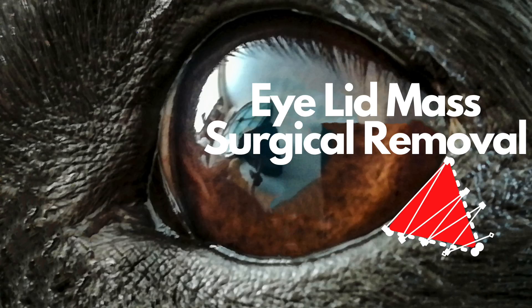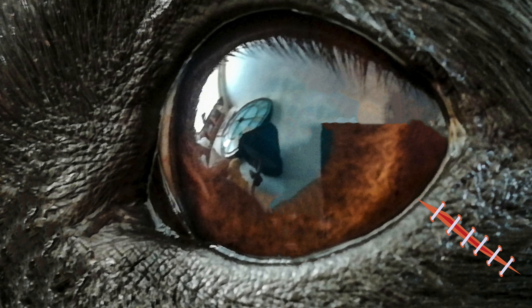After you do that, the veterinarian will close it with an interrupted pattern using a very small suture. In most cases, the veterinarian will do a two-layer closure, opposing the eyelid margin so it's nice and perfect. The eyelid margin needs to be perfect — you need to bring it together beautifully so when the eyelid closes, there's nothing off about it.